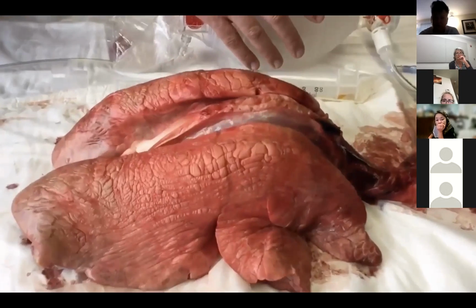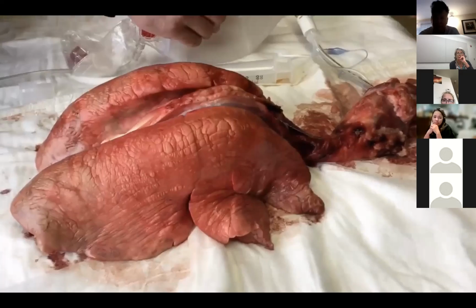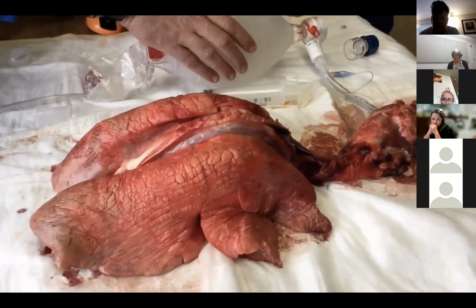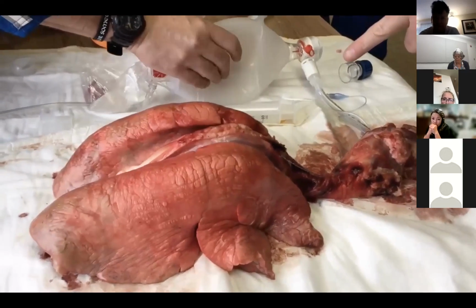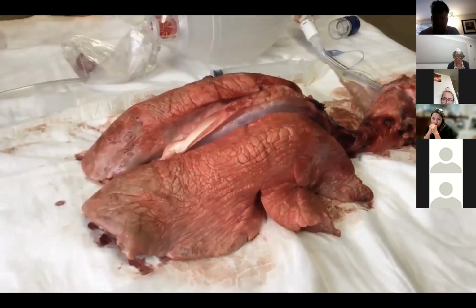That's what happens. We lose all our pressure. And then some, like you were in the negative. So it clinically doesn't make sense for anybody on a ventilator to put 6 to 10 to 20 a PEEP. Oh, I don't know what's going on, the ventilator's alarming, pulling them off and BVing them without the PEEP valve on. They clinically cannot get that. People squeeze faster, but that's horrible.